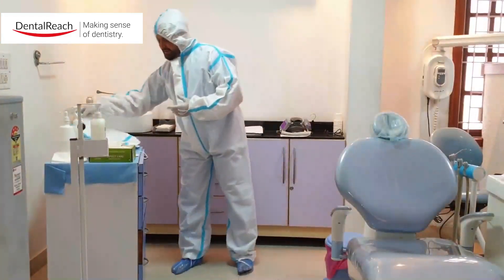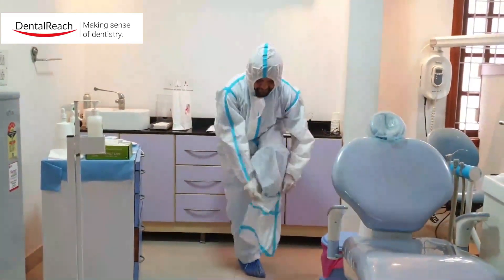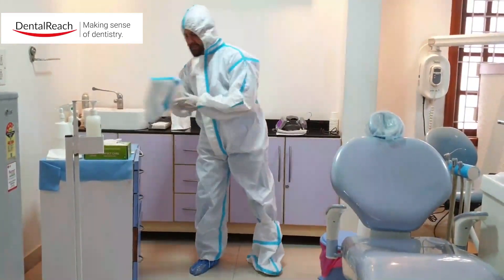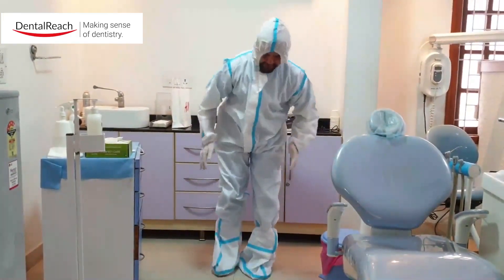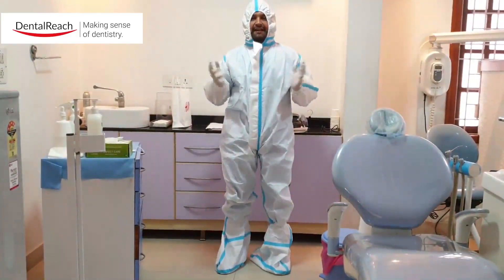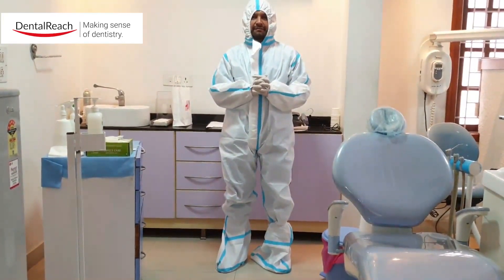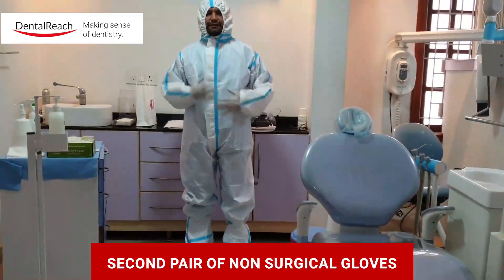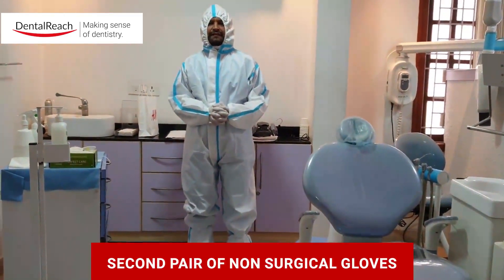Now I wear the leg protection on the left, then the leg protection on the right. I'm already all set to go into the next procedure. Once we finish off with the major part of wearing the gown and the feet cover, we use the second pair of gloves.